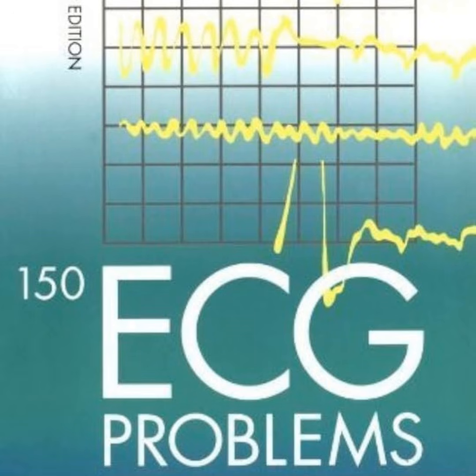This is such a critical distinction. Let's start with a really challenging ischemic presentation. Say a patient arrives with crushing chest pain and an ECG showing acute anterior ST elevation. However, they report the pain started over 18 hours ago. Okay, so conventionally, strict textbook protocols might suggest they are well outside the window for thrombolytic therapy because you'd assume the myocardium is already fully infarcted.